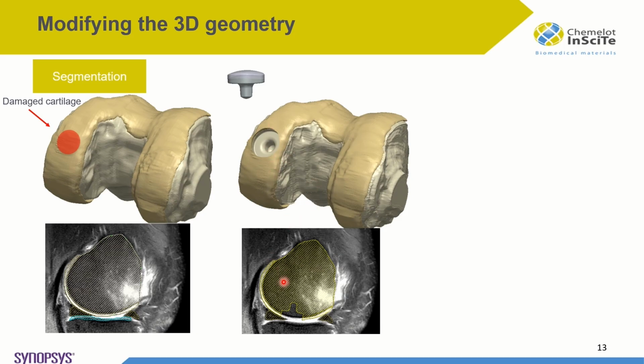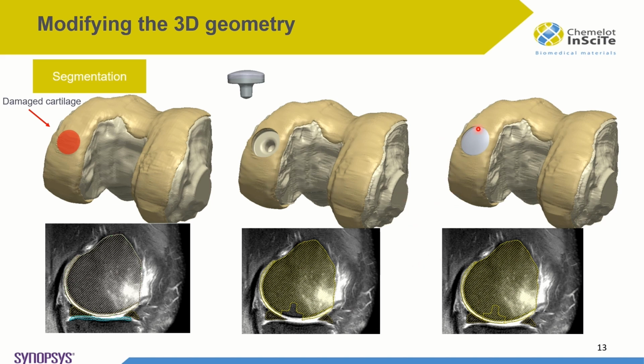And during this operation, it also updates the mask automatically on the go, which is a nice feature. And later on, you can also position the implant to its relevant place. And from the slices, you can also check if the implantation position is accurate and proper.